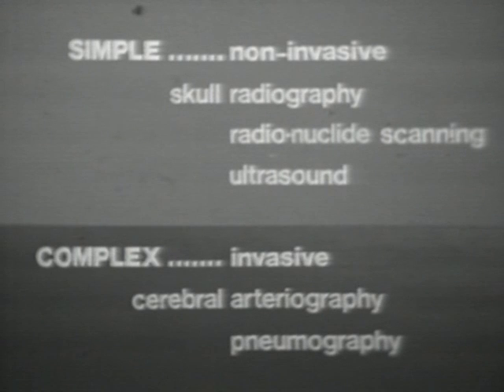If I were a patient, I think I'd be scared to death at the mere thought of having any of the last two mentioned investigations performed on me. Now, it is an unfortunate fact that each of these investigations allows us only a very restricted look at the structures which comprise the whole cranium.